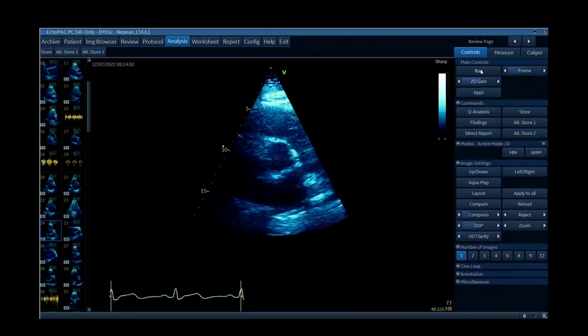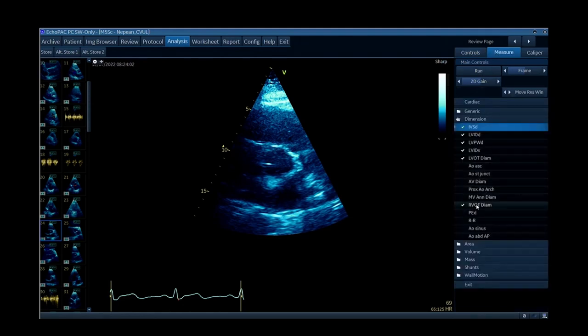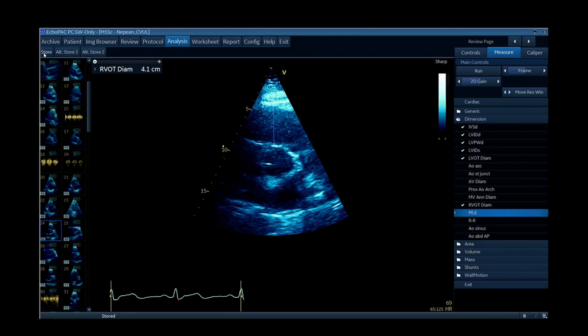To get the distal RVOT you need to look slightly higher than the aortic valve for the proximal RVOT, and sometimes tilt the tail of the probe toward the patient's right to look further across to the left side. On this view we wouldn't measure because we're losing half of the structure — you need to bring the tail more medially to get the full RVOT, pulmonary valve, and pulmonary artery into view. Using the tilt function, narrowing sector width, and adjusting B-colour maps or dynamic range can all help improve that border definition.